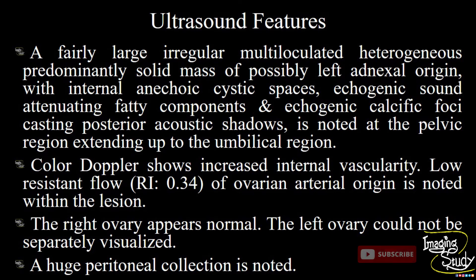In summary: a fairly large, irregular, multi-loculated, heterogeneous, predominantly solid mass of possibly left adnexal origin, with internal anechoic cystic spaces, echogenic sound-attenuating fatty components, and echogenic calcific foci casting posterior acoustic shadows, noted at the pelvic region extending up to the umbilical region. Color Doppler shows increased internal vascularity. Low-resistance flow of ovarian arterial origin is noted within the lesion. The right ovary appears normal but the left could not be separately visualized. A huge peritoneal collection is noted. Our diagnosis was teratoma with malignant transformation.